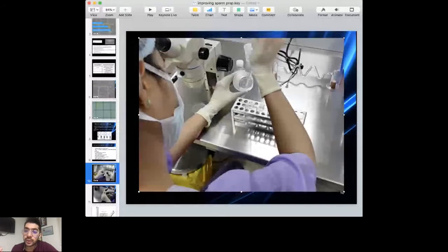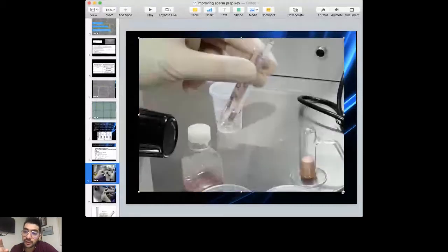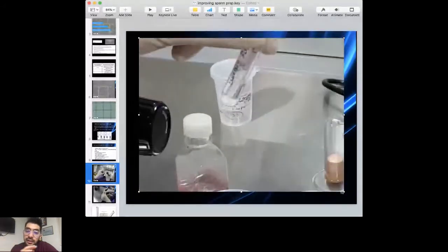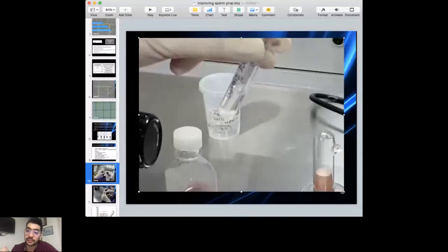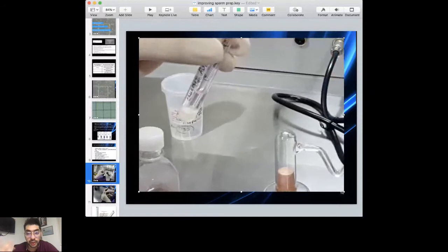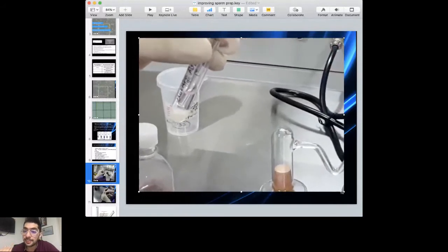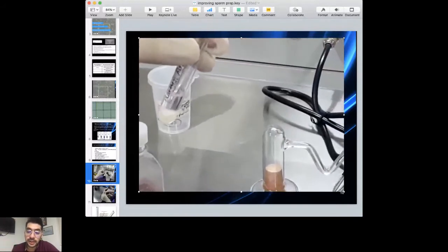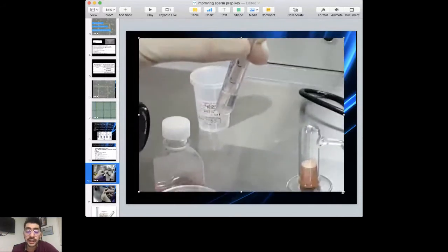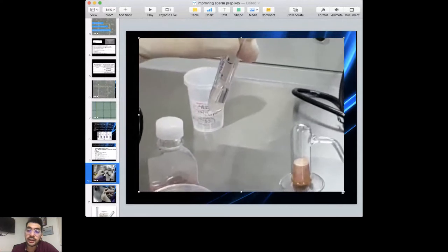Second thing that I want to do is underlay the sample. We're going to load 0.5 ml of sample in a pipette and gently release the sample below the media. This step is also very important. You could first put in the sample and then put in the media. Why do we not want to do that? Can anyone answer that question? Why are we underlaying this sample?